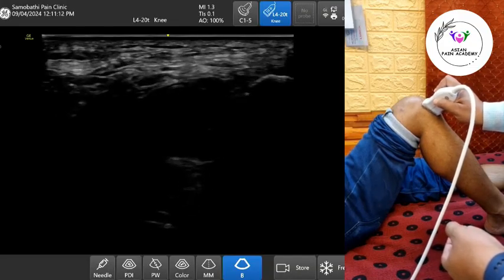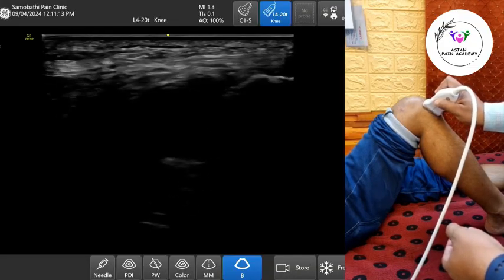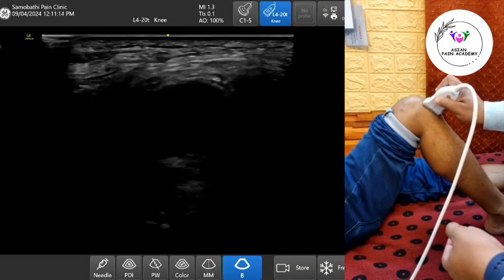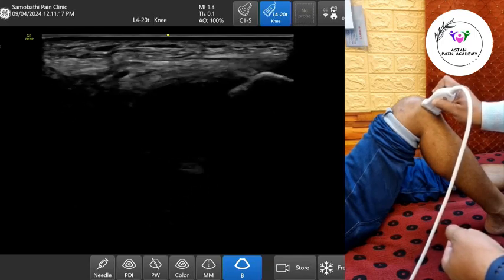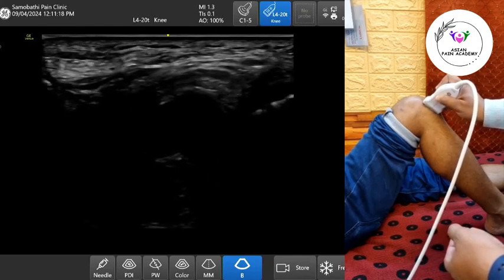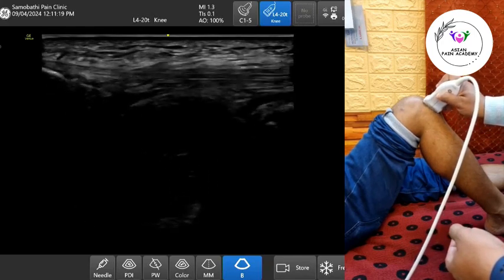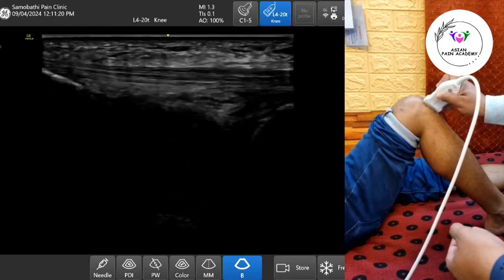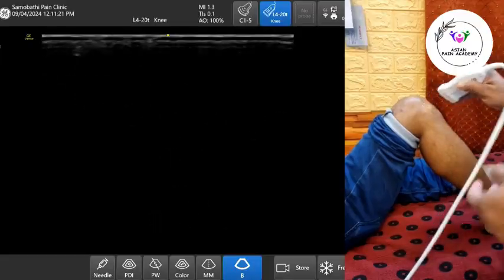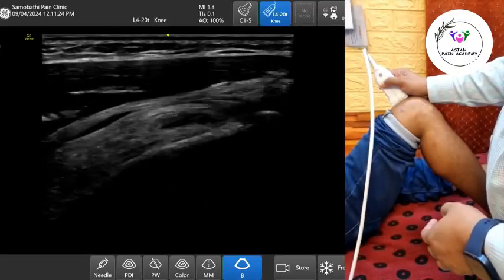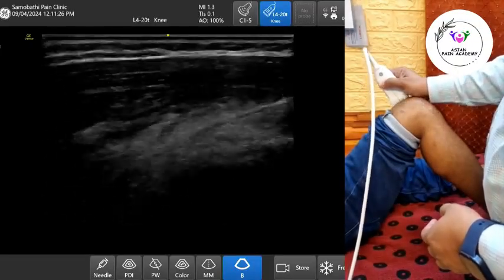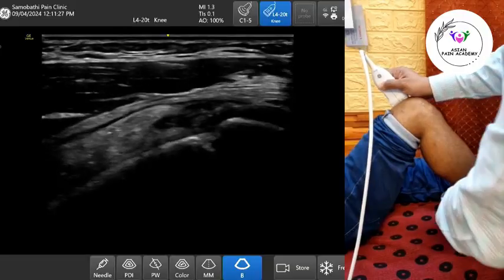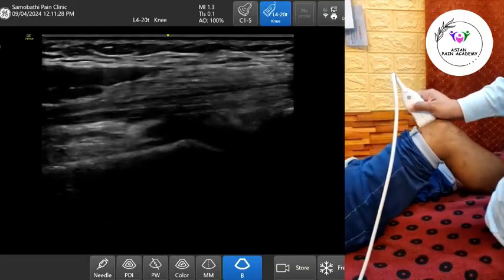Now scan in the transverse plane, just below the patella. In early or mild cases, fluid tends to accumulate in the lateral and medial-dependent recesses, giving the bursa an hourglass appearance. These can easily be missed on midline sagittal scans.